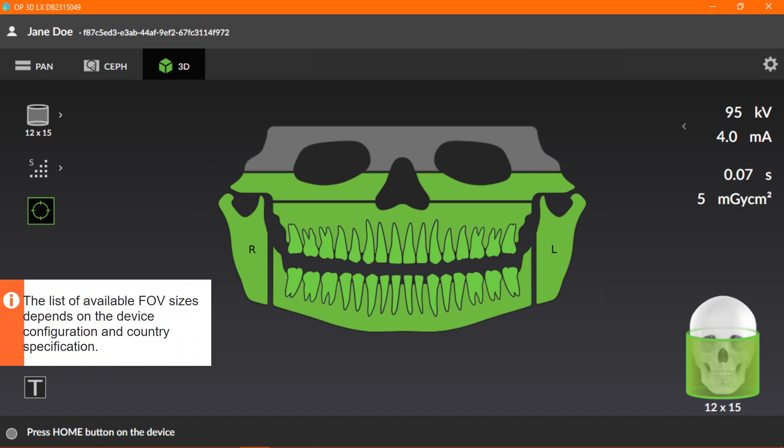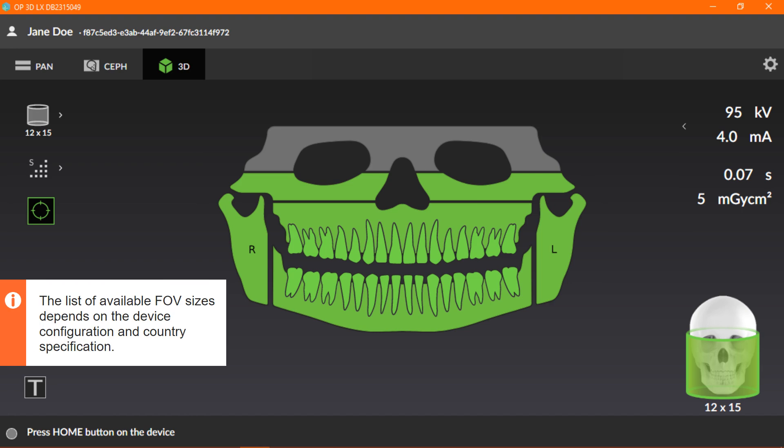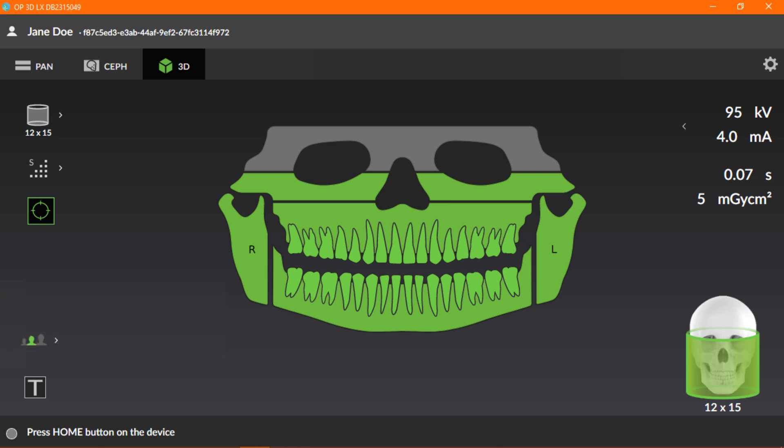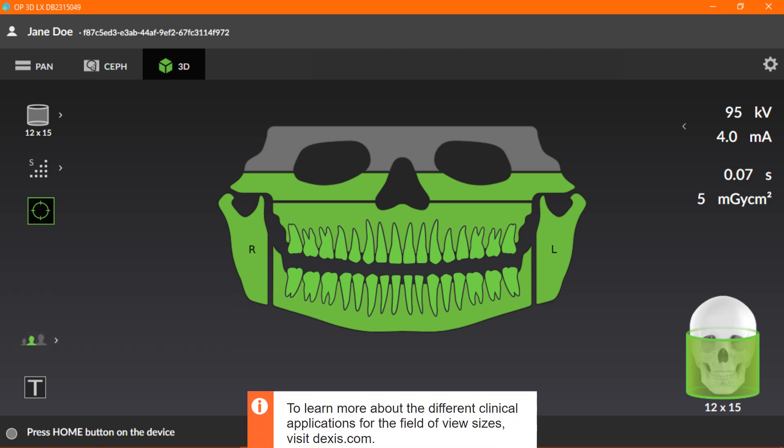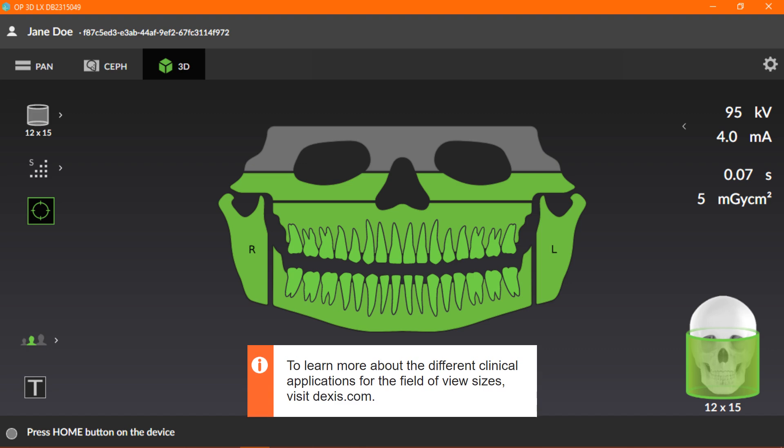Also note, the list of available FOV sizes depends on the device configuration and country specification. To learn more about the different clinical applications for the field of view sizes, visit Dexis.com.